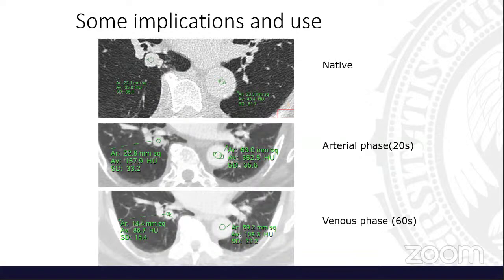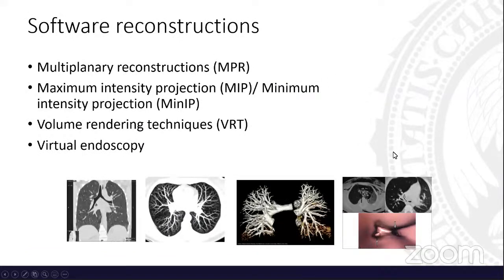The amount itself, for example, we can measure the density of a pleural effusion to tell if it's blood, exudate, or transudate. We can do that, but if you just measure one number, it's not that specific. Sometimes blood can be really hypodense. Sometimes exudate can be really, really dense. So the results in this area are not great. But when we are doing multiphase CTs, the densities are great to use. There are a lot of cool things I will show you.